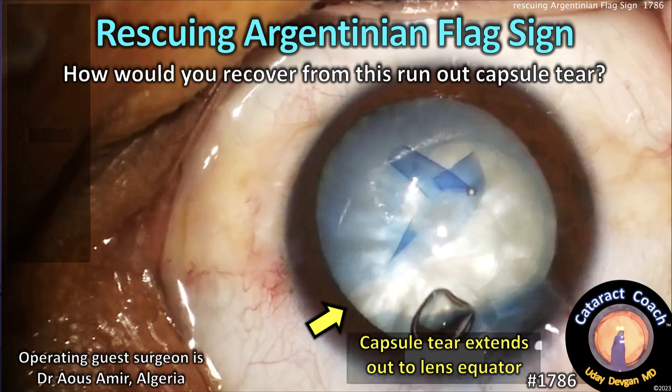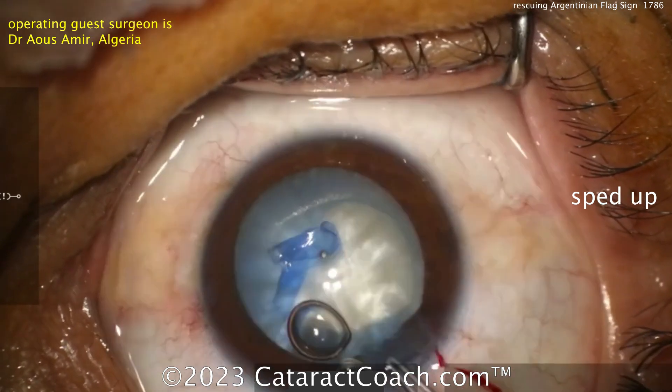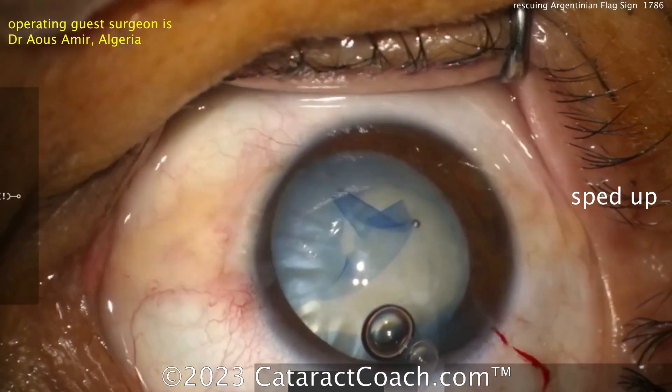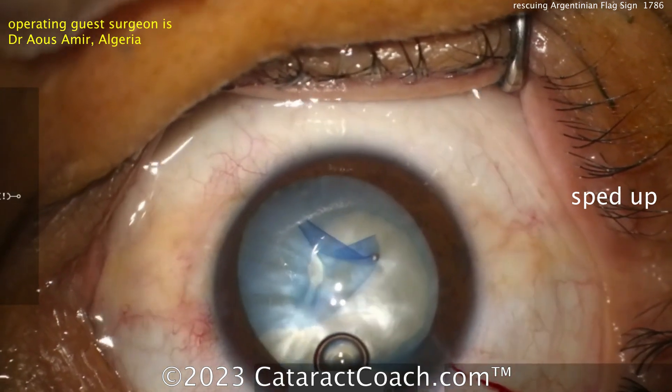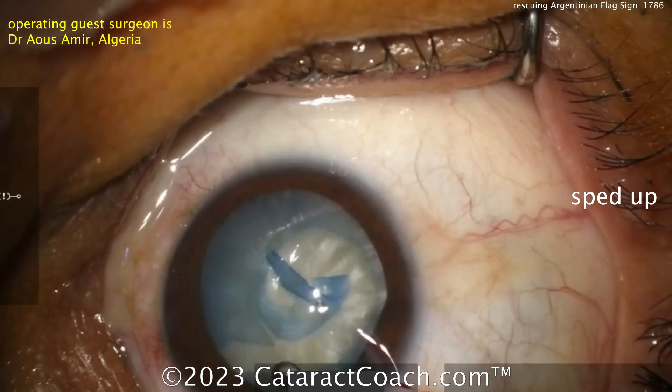cataractcoach.com — rescuing that Argentinian flag sign. How would you recover from this run-out capsular tear? Watch carefully. Look where the rhexis edge is, and boom — out it goes. It's already out to the zonular attachment points, all the way out to the lens equator. Now what?